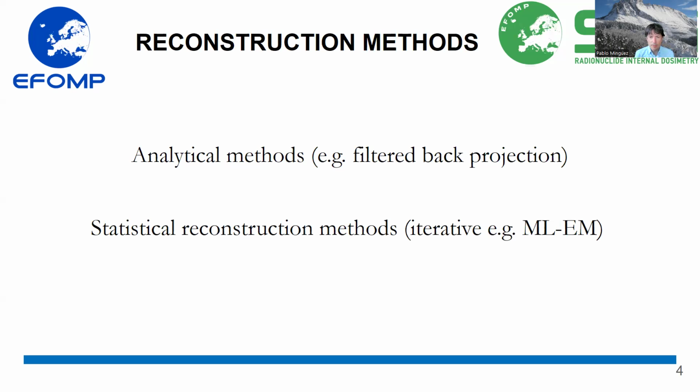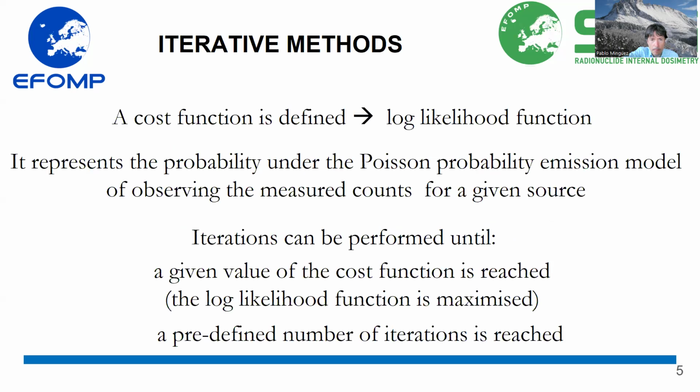Those iterative methods are currently the methods used because they are less noisy than the analytical methods. So I will briefly summarize the iterative methods.